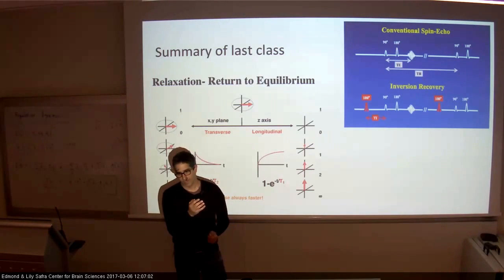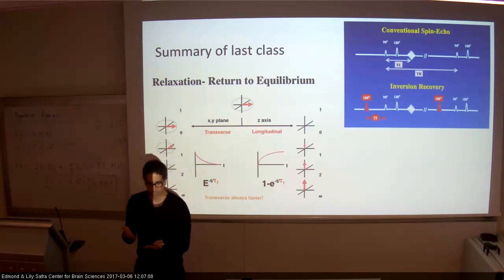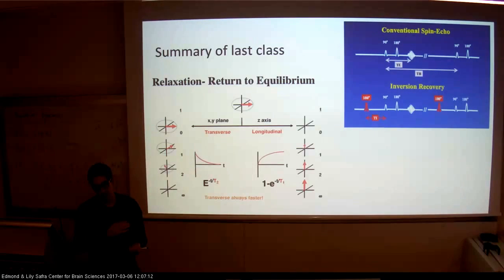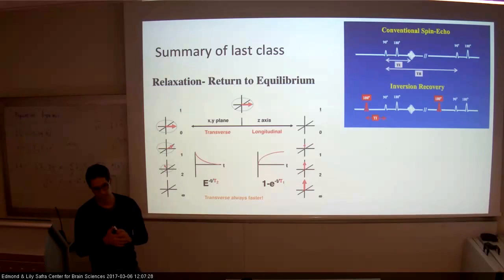But when you do the 90, don't you have the signal already? Yes, and then it starts to dephase, and I'm not measuring. My measurement is not perfect. It's taking time, and so on. So the 180 allows me to get another point in time in which I can measure a signal. If I wouldn't do it, it would be a free induction decay. I couldn't do inversion recovery on a gradient echo. Actually, the measuring is typically done on a spin echo.